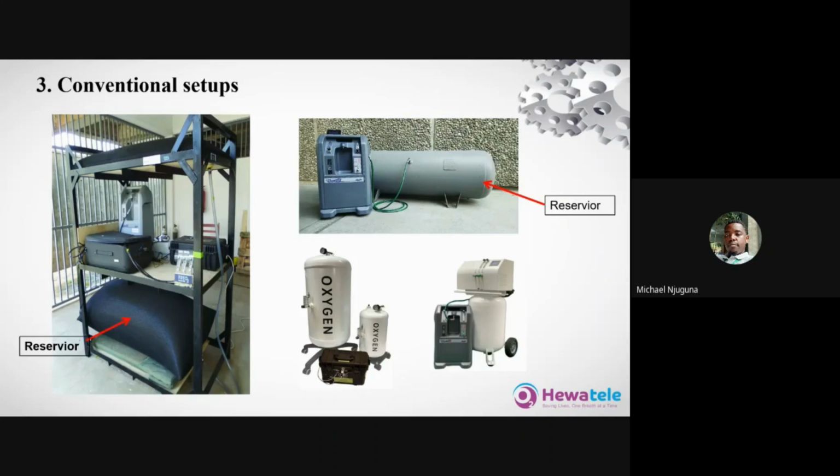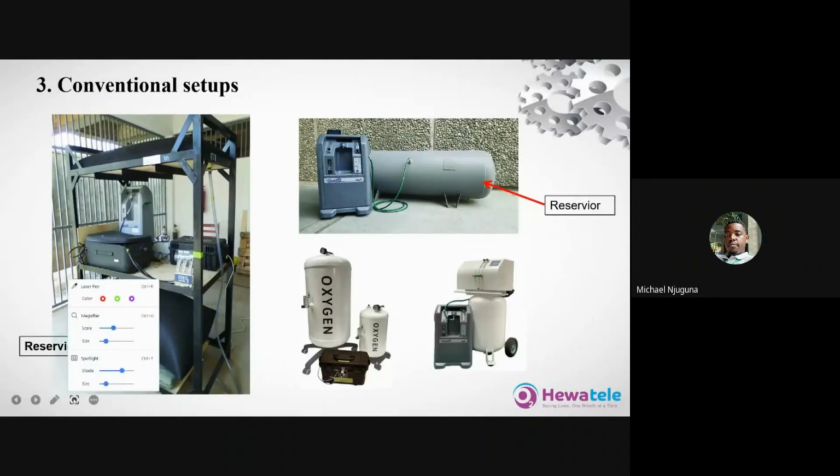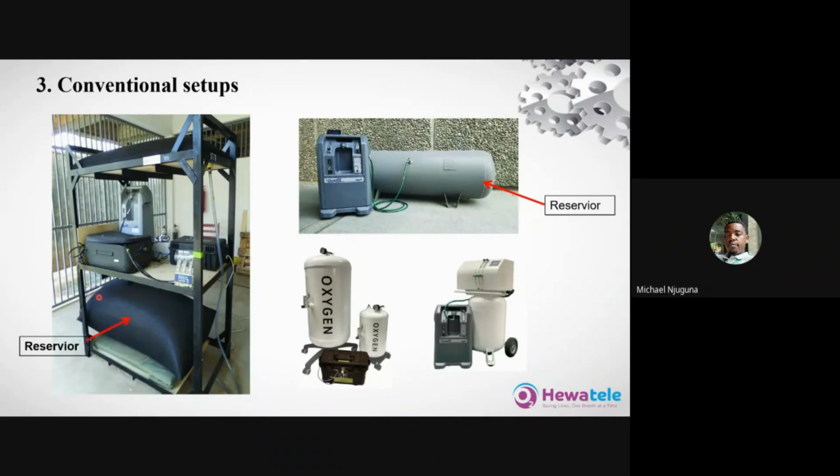So a conventional setup, as we mentioned in the previous slide, is that there is an oxygen concentrator, which is the oxygen source. We also have a filling station and a reservoir. In the extreme left part of the slide, you can see an oxygen concentrator in this setup.